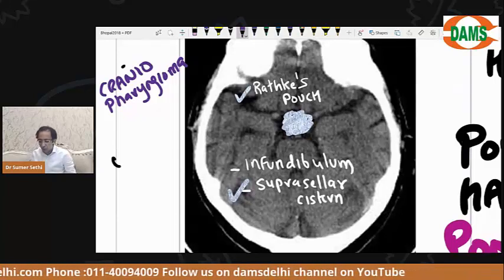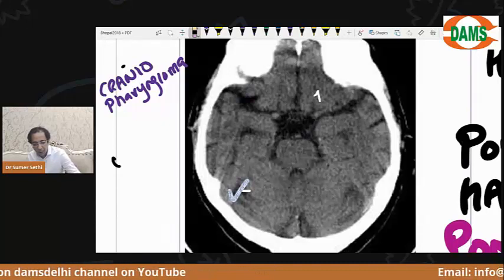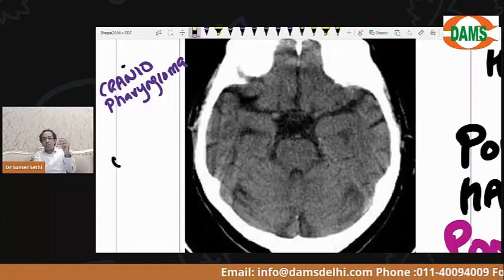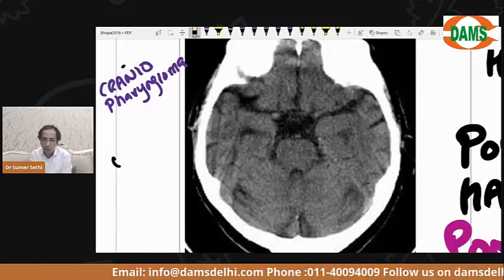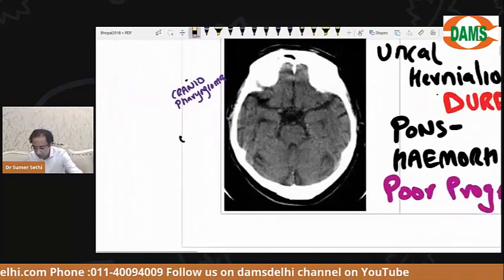Everybody understands this? Very good. I can see most of you are able to understand. Somebody was asking, why do we need to know about the suprasellar cistern? Because that is the place where you look for craniopharyngioma. Very good. I can see most of you are able to answer.